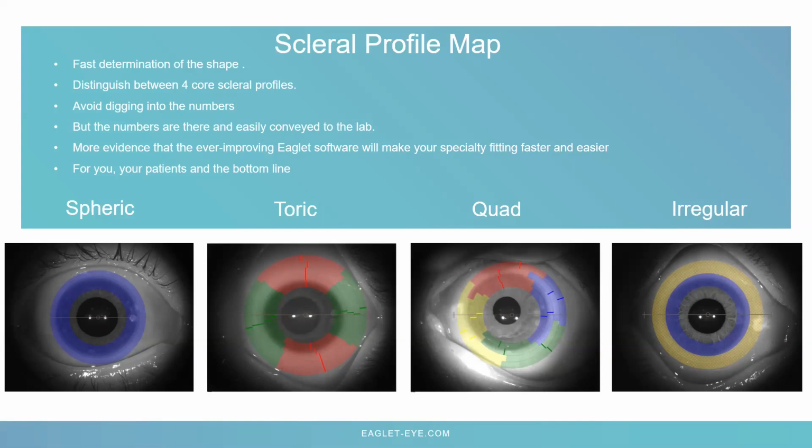Is this focus automatic, or do you have to focus it yourself? You have to focus it yourself, but we believe we've created a very intuitive system to help the operator do that. Okay.